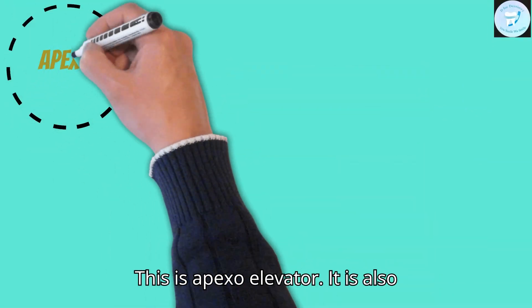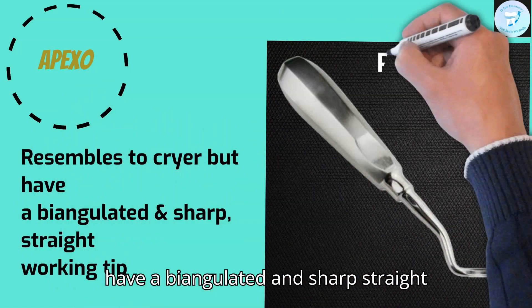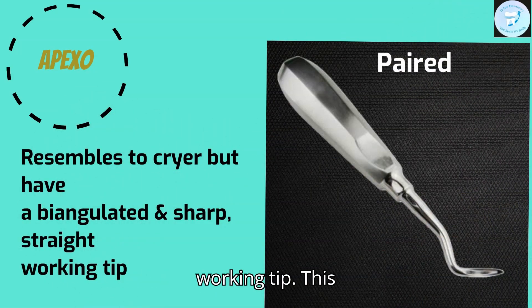This is Apexo elevator. It is also paired. It resembles the Cryer but has a bi-angulated and sharp straight working tip.